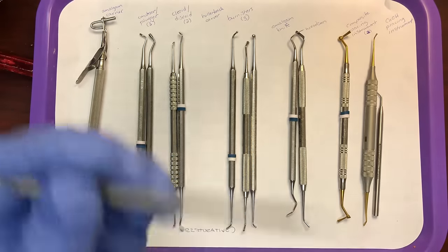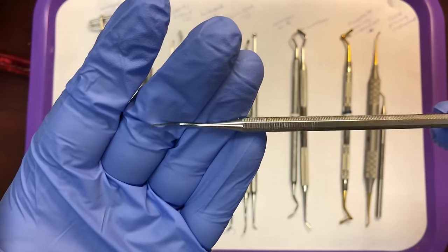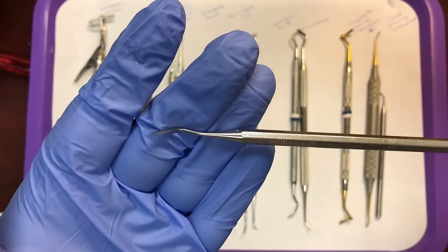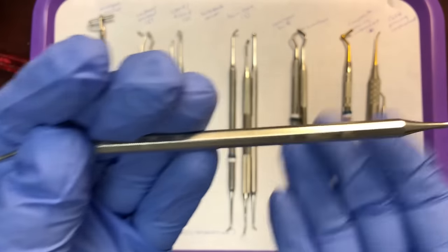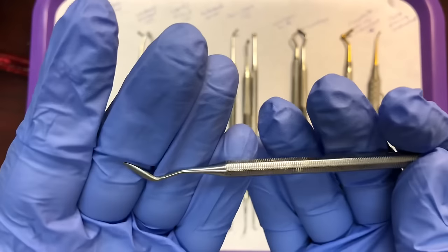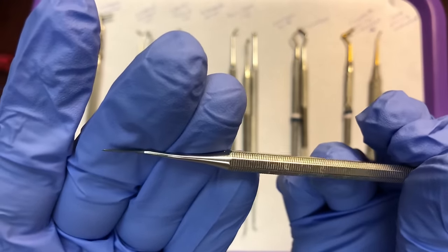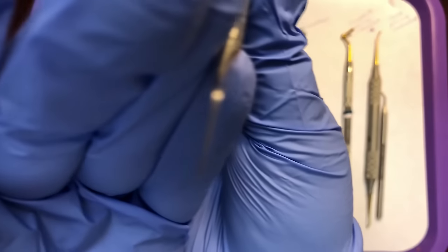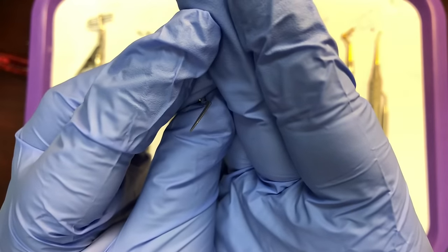The other carver, for working interproximally rather than on the occlusal, is the Hollenbach carver. It's used to carve the mesial and distal sides of the amalgam, and it's double-ended to fit on both sides. It has a more spear-like appearance to the working end and is very thin so it can fit between the teeth interproximally.